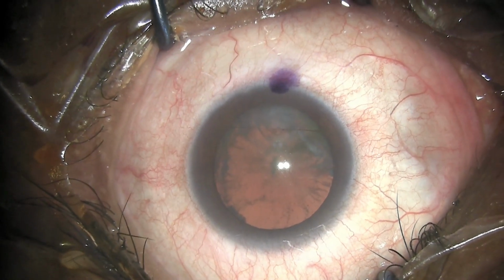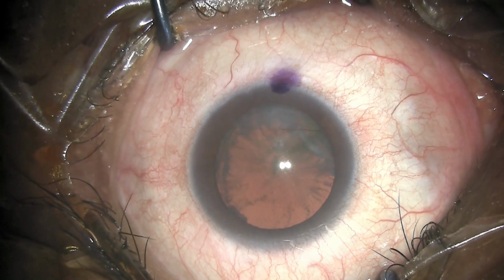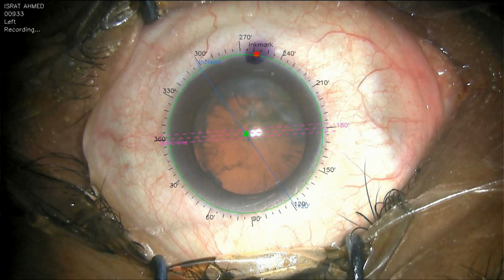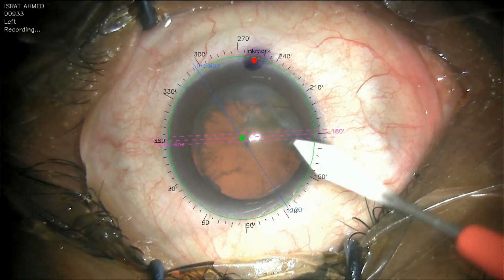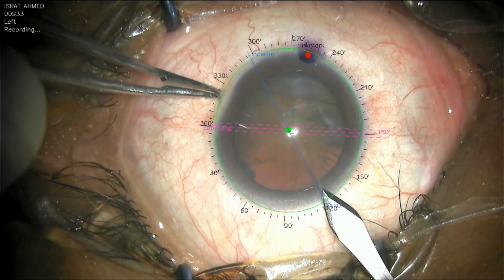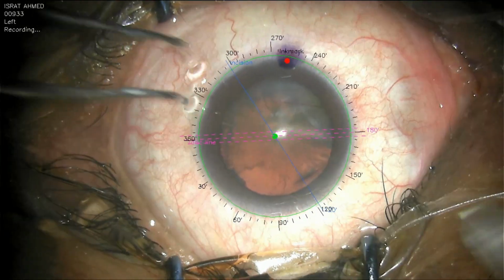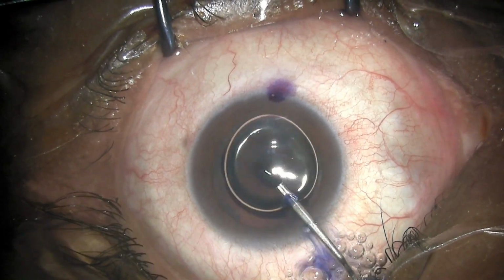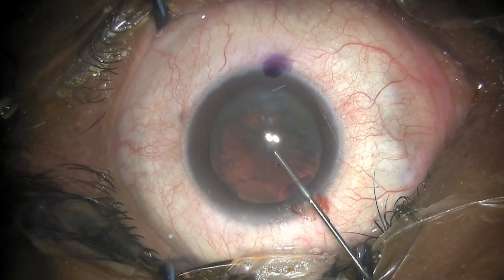So this is the microscope view of the eye. You can see the ink mark down. Very soon I'm going to put on the marking system, and you can see here it is. Initially I'm going to use it for the incision marking, which I have done at 120 degrees. And this is, once I make the incision, I'll put off the marking system again and put it on once I'm dialing the Toric IOL. So now this is the normal view. Once again I do the routine procedure.